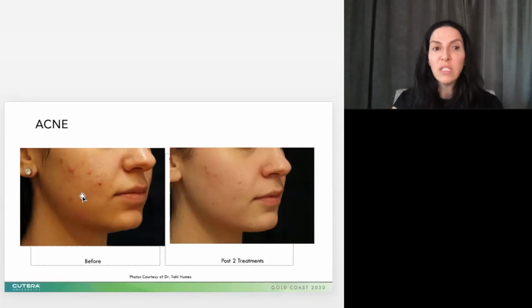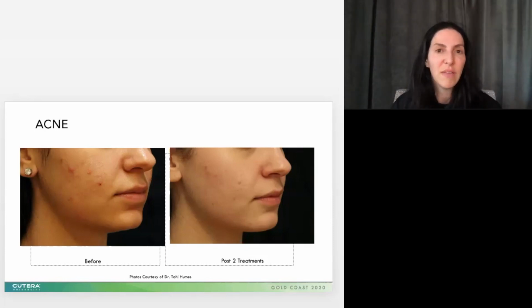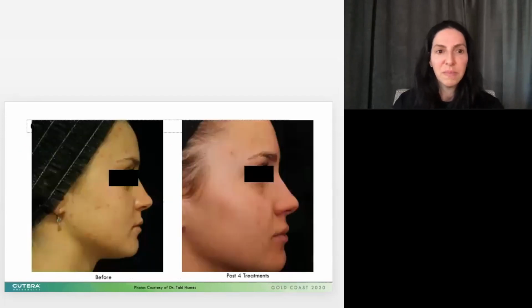Now, I don't treat just on those pustules. I treat the entire cheek in that area, and then I'll go ahead and treat her other one. If there's no acne on the forehead, I don't necessarily have to treat that, but I try to take a look and see what is going on with their skin. The thought here is that this 1064 wavelength is drying up the P. acnes, the bacteria that causes acne, and we're able to dry that up and reduce their acne. Will it last forever?